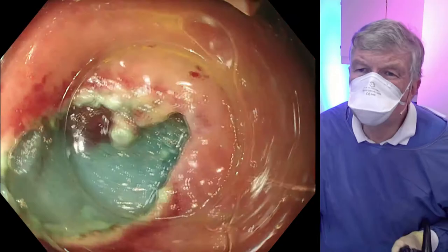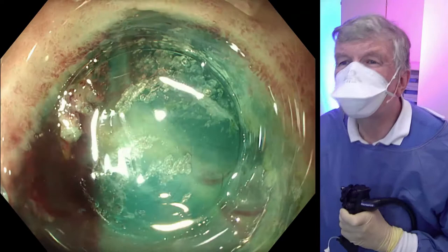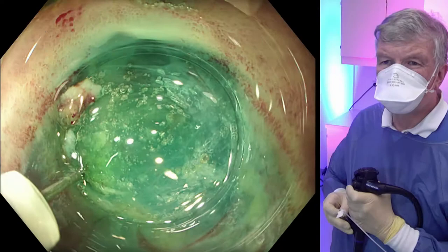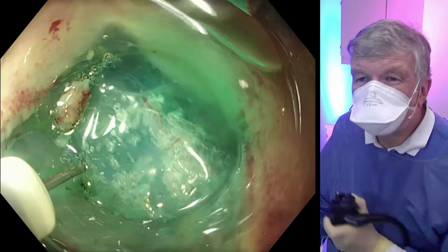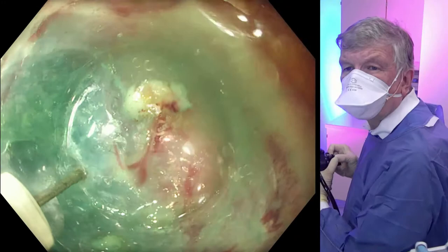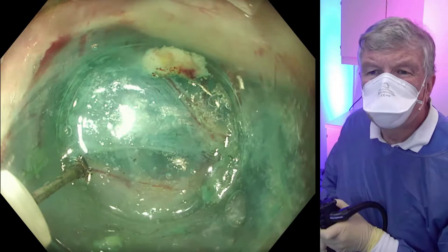We are finally able to wiggle the instrument in with the cap. The direction is upwards. We do some re-injection to enlarge the submucosal space to accommodate the endoscope. It takes a little while until we have enough space to be in the tunnel and not slip back. Here are some vessels which we have to coagulate if we hit them.